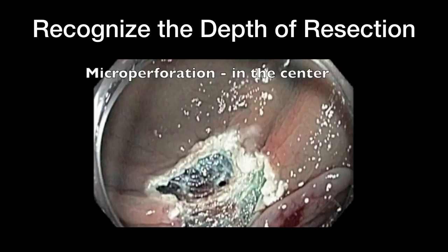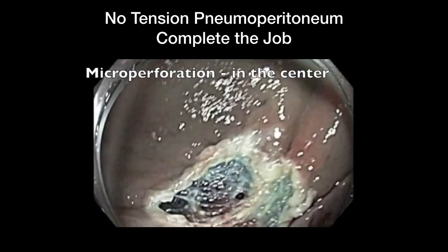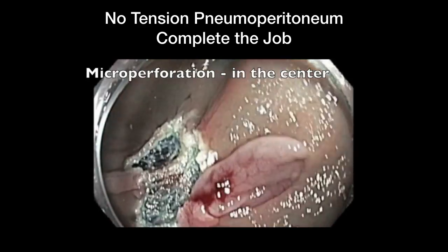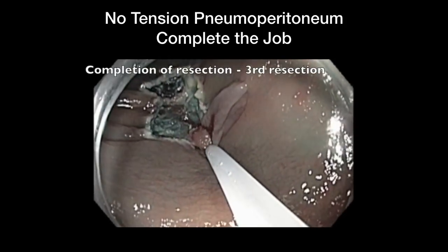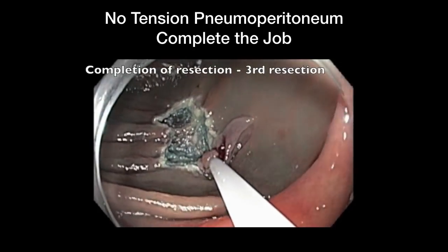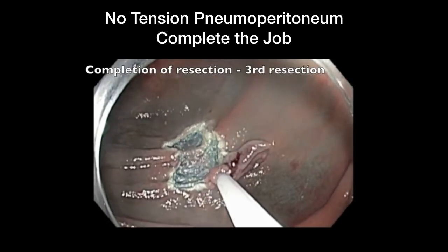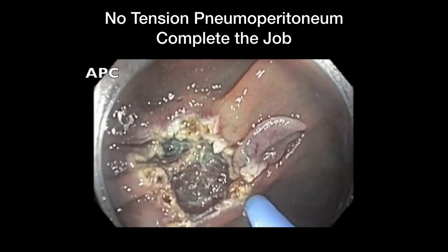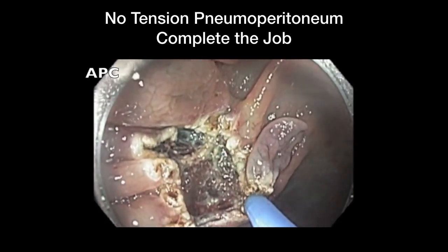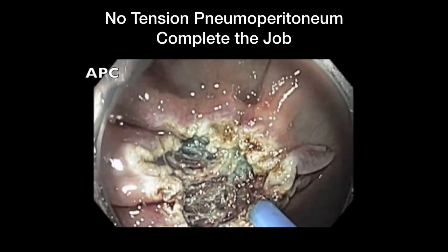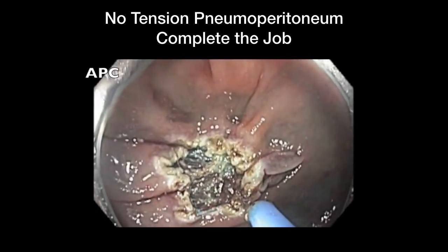Once you find that there is a perforation, the next step is to make sure the patient has no tension pneumoperitoneum. If that happens, you stop the procedure, do not pull the scope out, decompress the abdomen with a large-bore angiocath, and then come back and close the perforation. In this patient, there was no tension pneumoperitoneum. We noticed there was a little more polyp tissue left at the lower edge, went ahead and did the resection quickly, then ablated the edge with APC to prevent local recurrence. As long as there is no tension pneumoperitoneum, you can go ahead and take care of the polyp until it is completely resected.